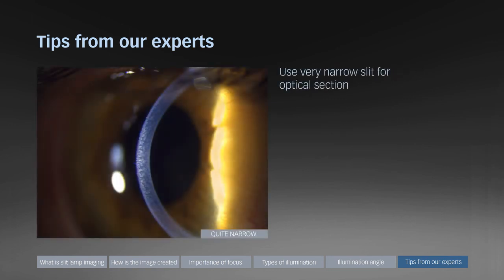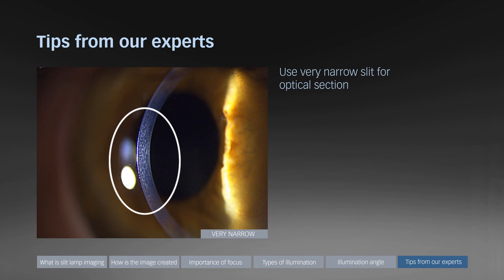Use very narrow slit illumination with maximum slit intensity for optical sections, otherwise you will lose detail. Here an example of a quite narrow slit where no detail in the cornea is visible. Here an example of a very narrow slit which reveals the different layers of this healthy cornea.